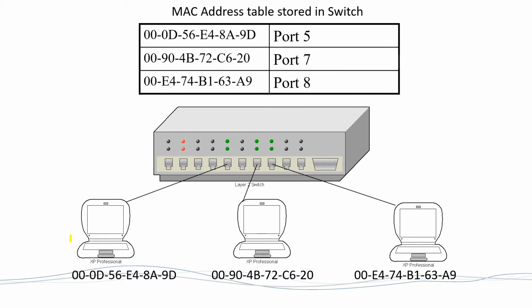So you may change a device on a network. You take out, I'm not saying Spacelabs monitors do this, but some competitors might, a monitor and you put in a new monitor. What have you changed on the network? What's different? It's a different MAC address, right? It's a different device, right? Guess what? Until this guy gets something from that device, it doesn't know that you've changed that, and it's not going to know where that is.